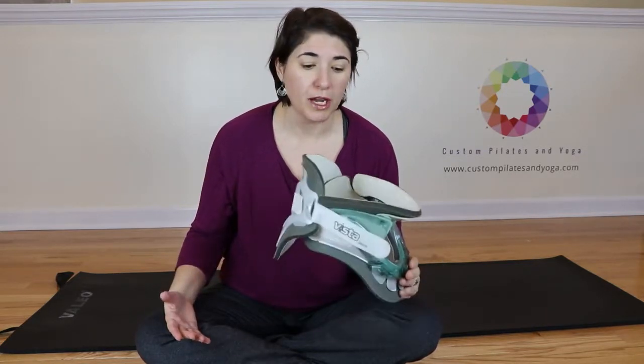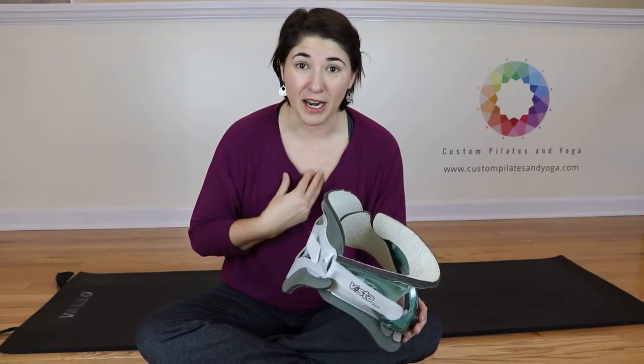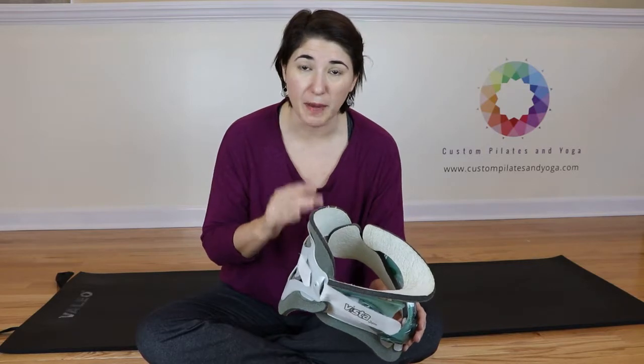Now it's possible when you got your neck brace — wherever you got that, the hospital was where I got mine — they would give you a replacement set of pads.